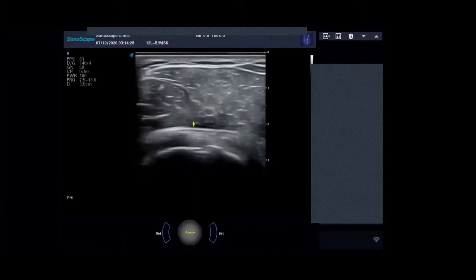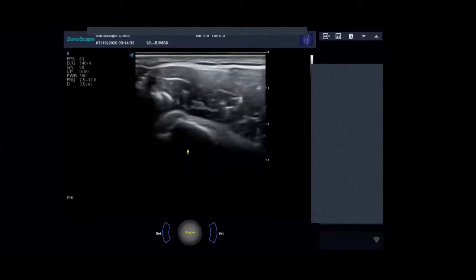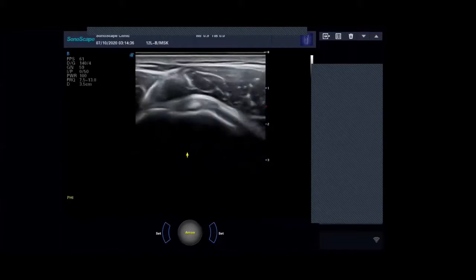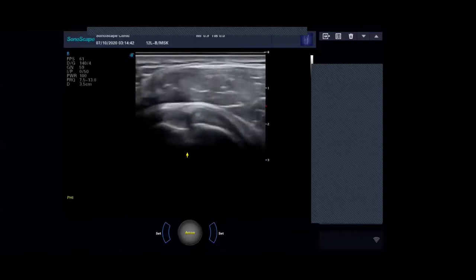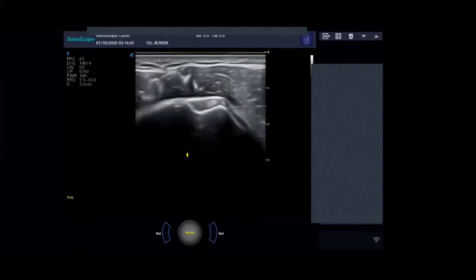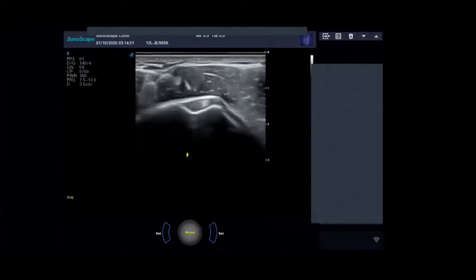Can I ask Adrian what landmarks you'd like to use to help to guide you to the appropriate place when you look at this biceps tendon? Well, my first landmark would be the groove. So I basically come down onto the shoulder until I see that groove, and that's my first landmark. And then I know I'm on the biceps tendon. Okay, thank you.